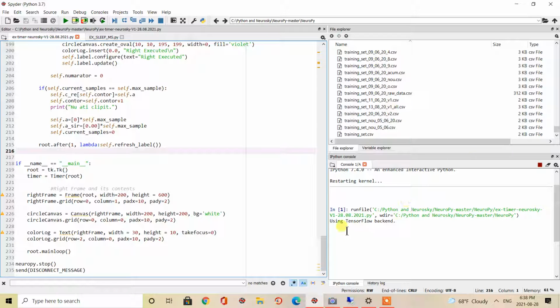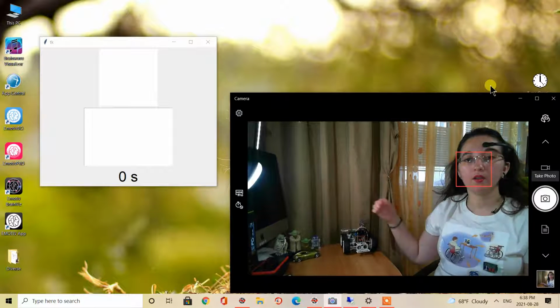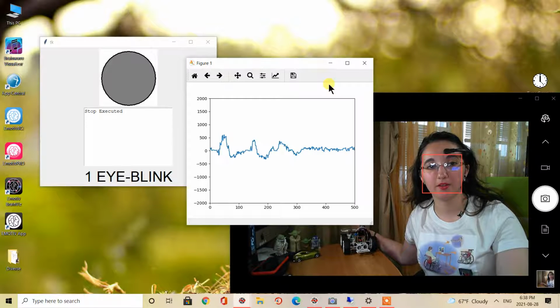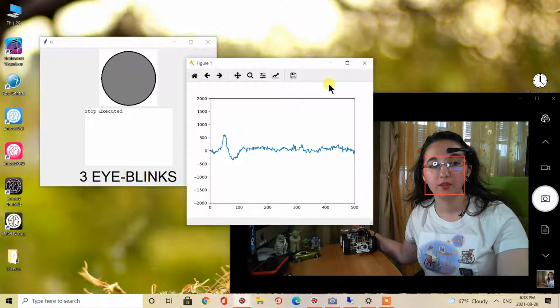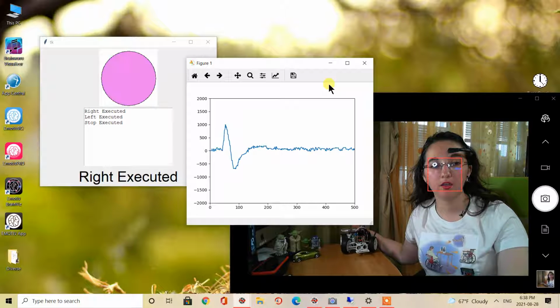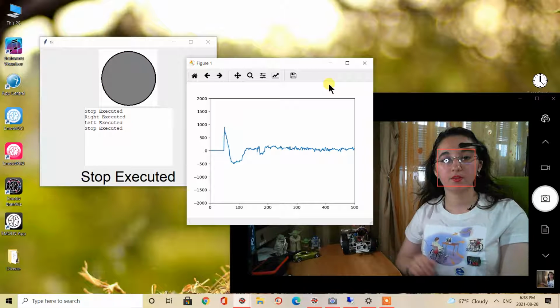Now we wait for NeuroSky to be loaded. And now we can send the corresponding commands. So, one eye blink is for the stop command. Two eye blinks determine the forward command. Three eye blinks are associated with the backward command. Four eye blinks are associated with the left command, and five eye blinks are linked with the right command. Stop command. This is the stop command.